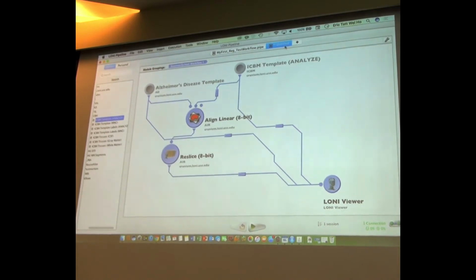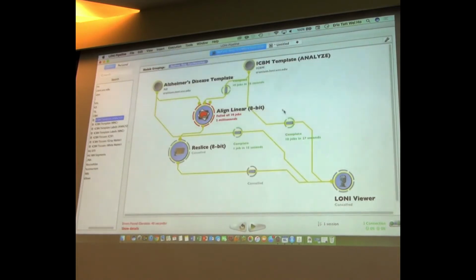I haven't saved this one, and my other one that I'm actually working on failed. So that's good. Failures are good. Why? Because if they don't kill you, they make you stronger, right? You learn from the failures. So let's see what's happening here. But I annotated my workflow that's still untitled. I may have to go back and do some of these annotations. Let's see what happened here.